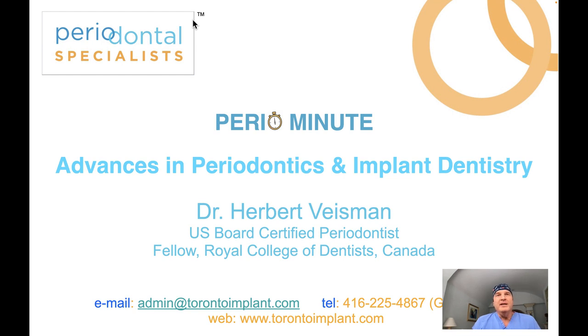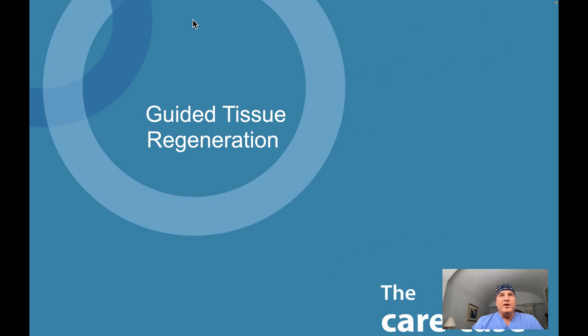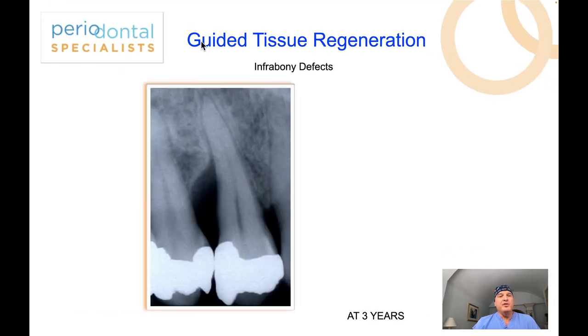As often happens with periodontal disease, bone starts to deteriorate around cementum. The challenge for periodontists then becomes, how do we then grow the bone back? In many cases, GTR is the only answer. We do this by employing various FDA-approved bone graft materials and resorbable membranes.